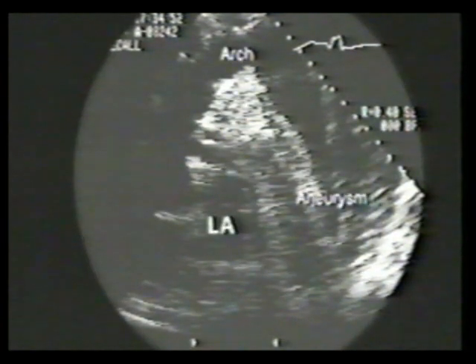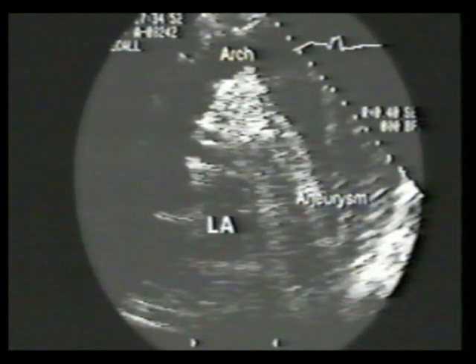This suprasternal image is from a patient with an ischemic cardiomyopathy who presented with severe low output failure. In real time, you will see a Swan-Ganz catheter in the right pulmonary artery, which is here in short axis. This is the aortic root and arch.